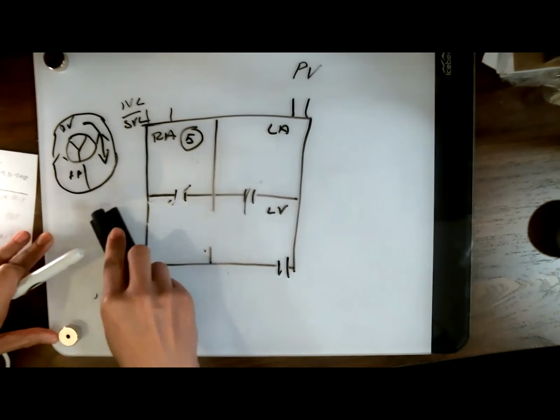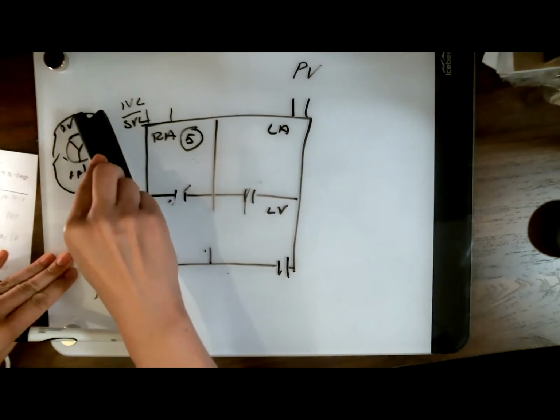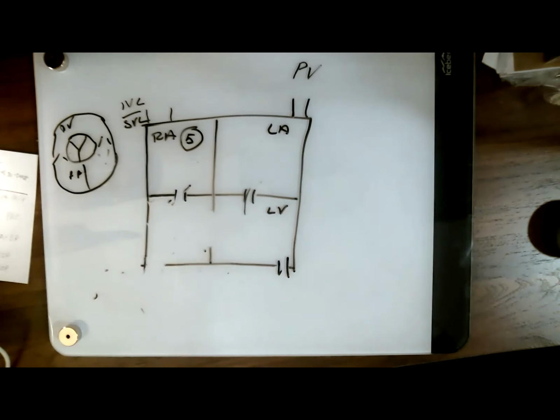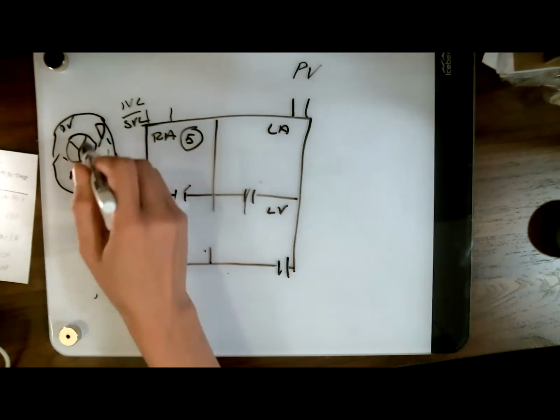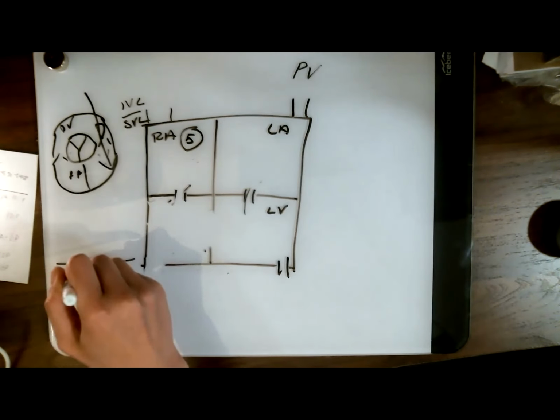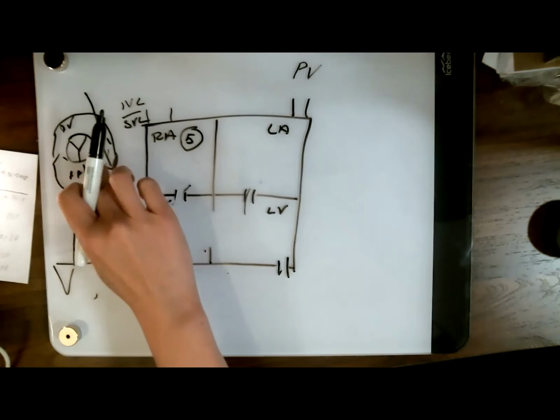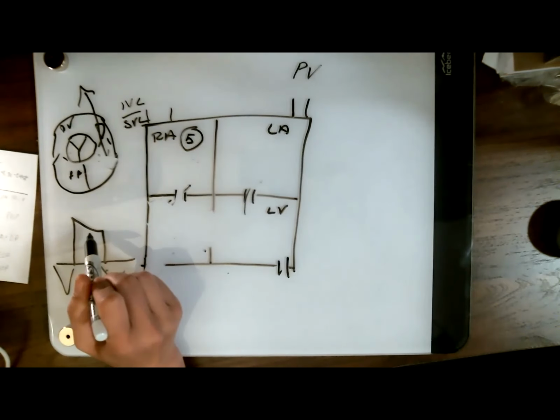Cool. So now let's do a different situation where you have a pulmonic artery here, and rather than pulmonic outflow, we get a little bit of regurgitation. Let's Doppler that regurgitation. That regurgitation should be above the baseline, right? Because it's shooting up into your probe. So this is your PR jet.